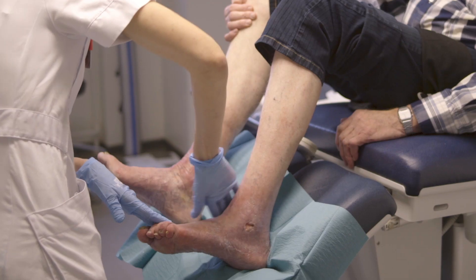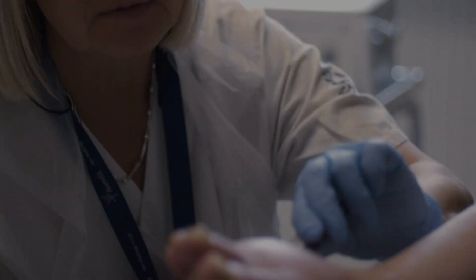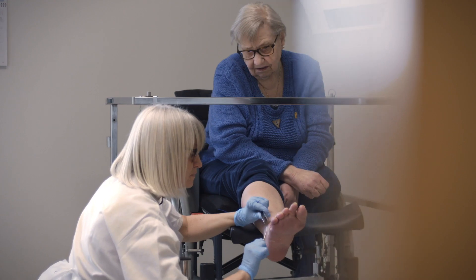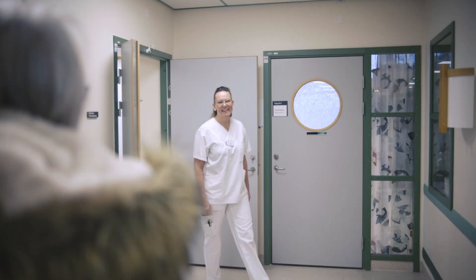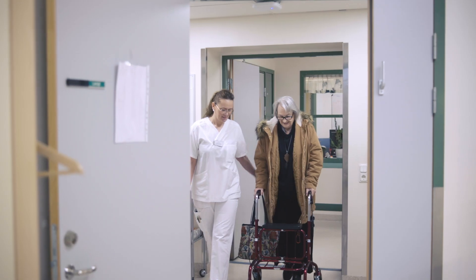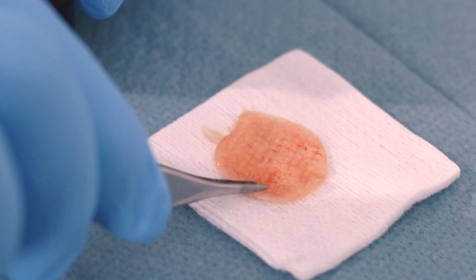The question is, what are we doing to turn this around? Our quest is single-minded: to ensure that patients get the treatment they need to avoid the burden of amputation. And with REAPLIC's 3C patch, it is now possible to heal previously unhealable wounds.